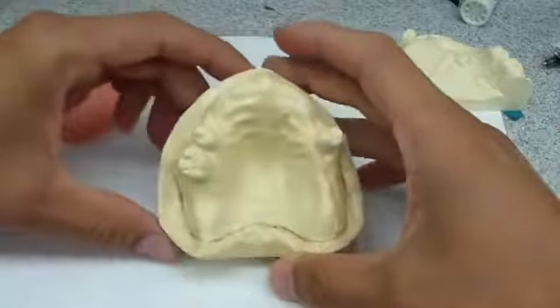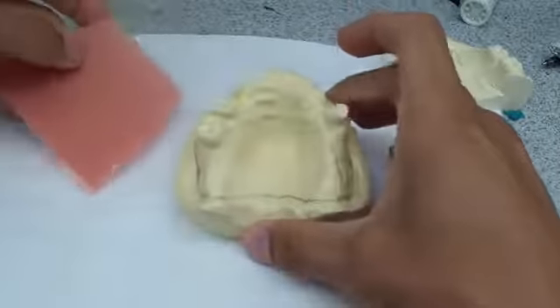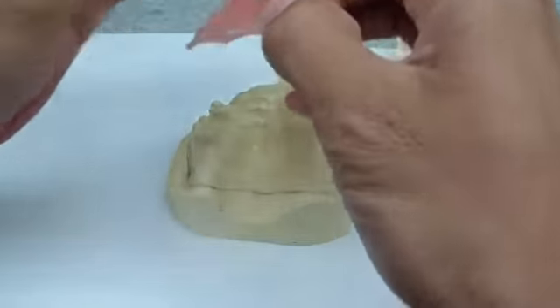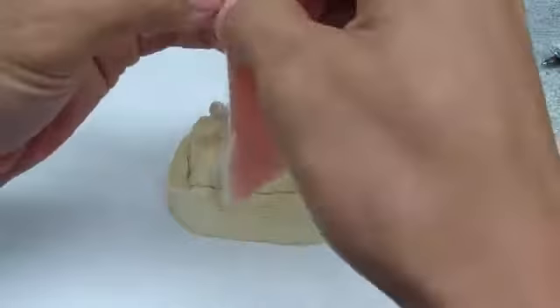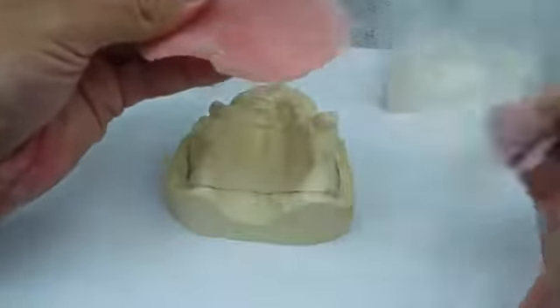Okay, so now I've Vaselined the entire cast, and what we're going to do is now take our Triad or visible light cured denture base material and fabricate our denture base.